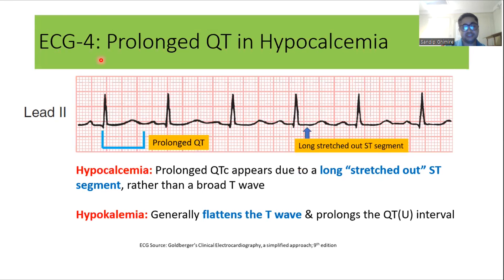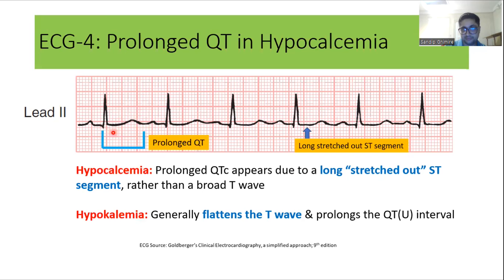This fourth ECG shows findings in hypocalcemia. As you can see, the QT interval is prolonged due to stretching of the ST segment — a classical finding of hypocalcemia. Sometimes there can be a pseudo-prolonged QT interval in hypokalemia, because in hypokalemia there is a T-wave followed by a U-wave, and when these merge they produce apparent QT prolongation that can be confused with hypocalcemia. To differentiate, look at the ST segment: in hypocalcemia, QT prolongation is due to stretching of the ST segment, not changes in T-waves or U-waves.